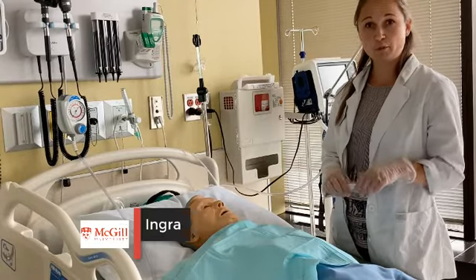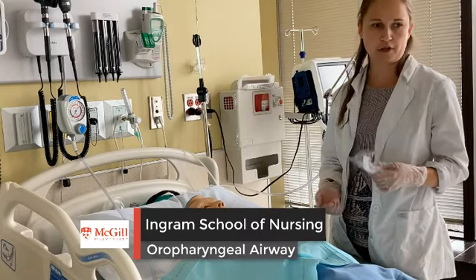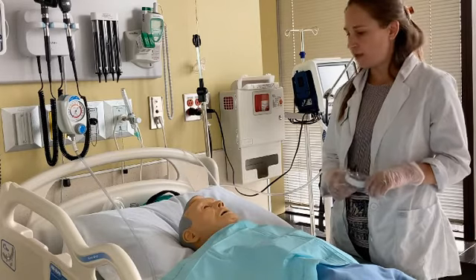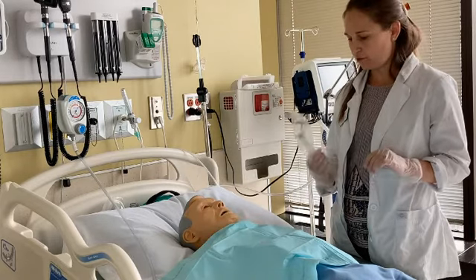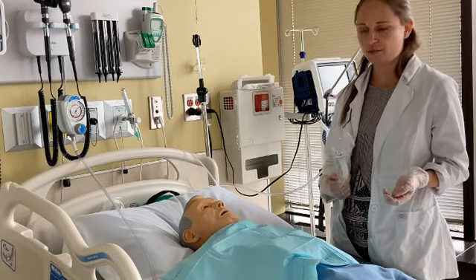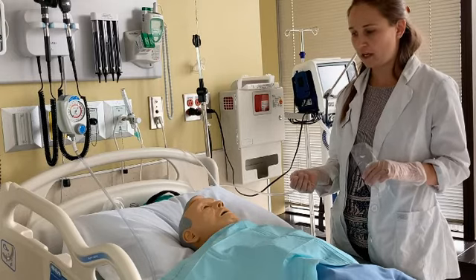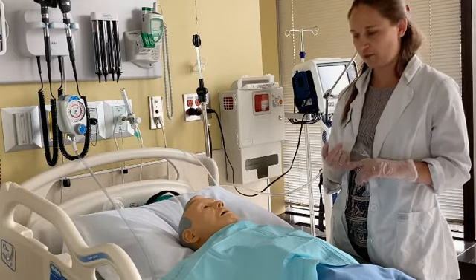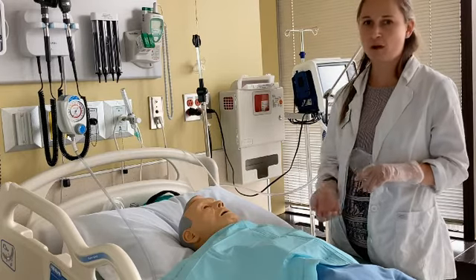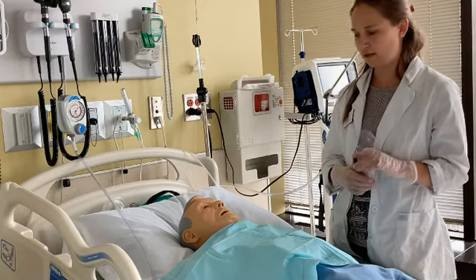In this video, I will show you how to insert an oropharyngeal airway in a patient who may require extra support for their airway. The reason why I might want to insert an oropharyngeal airway is, again, in a patient whose respiratory status might be compromised because of their airway, because their level of consciousness is, for example, decreased. There are a lot of secretions, and we are afraid that the tongue might roll back to the posterior pharynx and actually obstruct the airway.